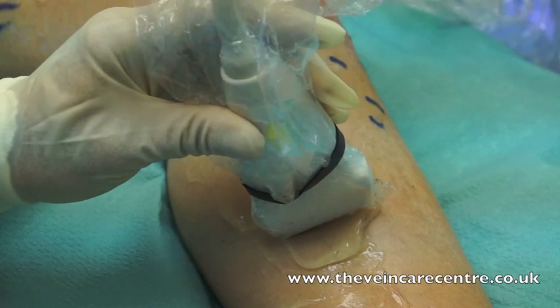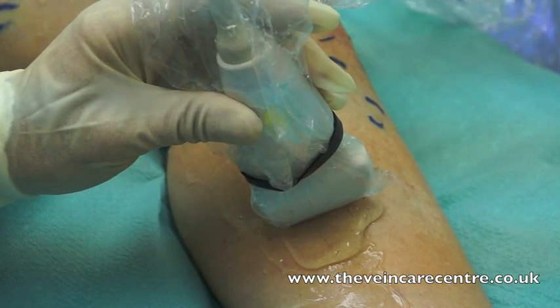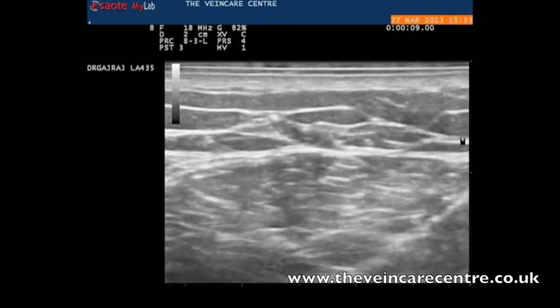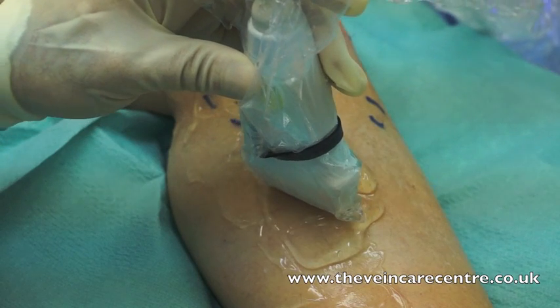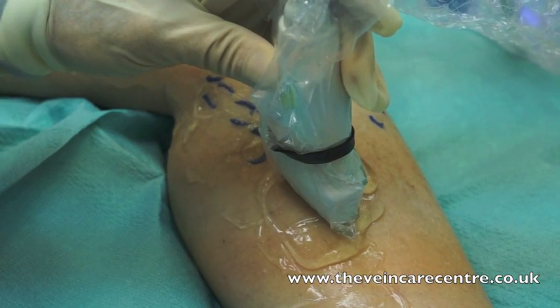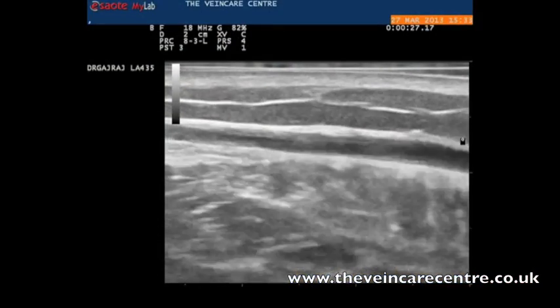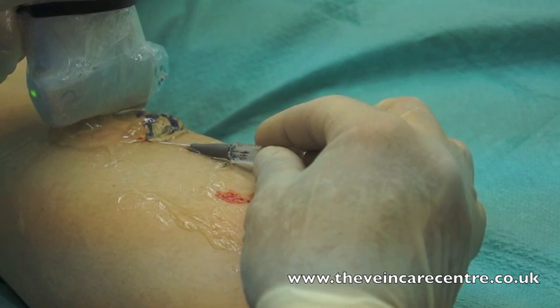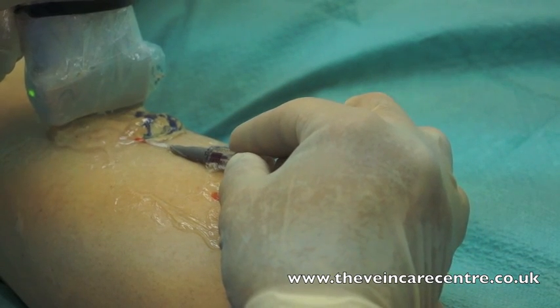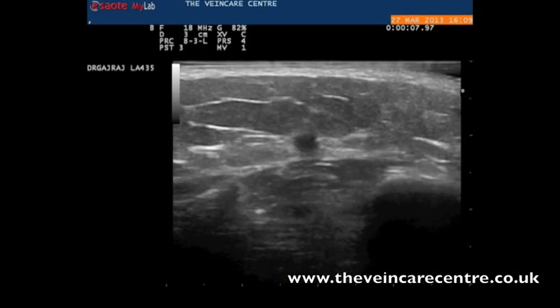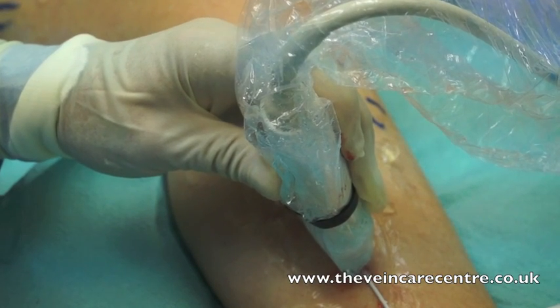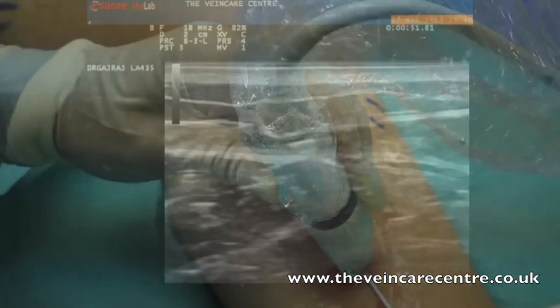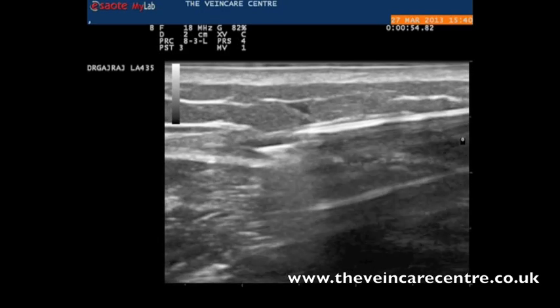Here we can see the vein being imaged in transverse section and compressed with the probe. Here is the corresponding ultrasound appearance. Here the probe is rotated at 90 degrees, and the vein is imaged in longitudinal section. Here is the corresponding image. The vein can be cannulated under transverse section — here we can see the tip of the needle coming down into the lumen of the vein. And in longitudinal section, we can see the needle being advanced within the lumen of the blood vessel under ultrasound guidance.